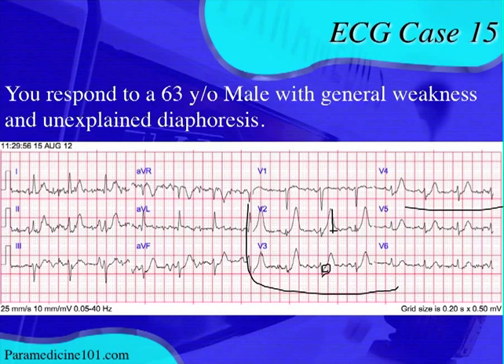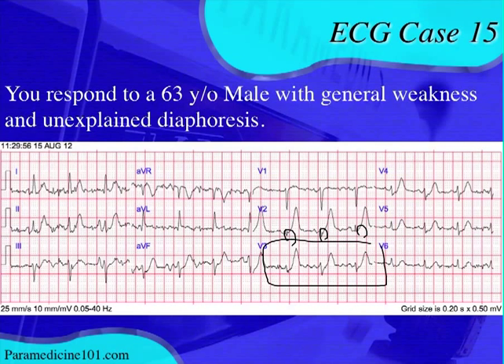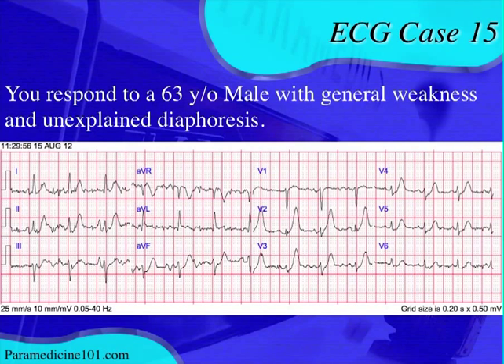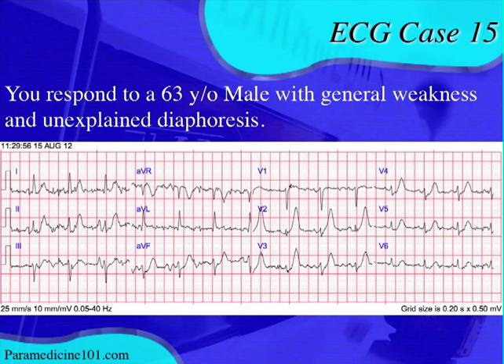Not only do you have symmetrical broad-base T waves, but you also have J point depression. It's hard to see due to the artifact, but the J point — there, there, and there — shows a little depression. You can see it best in V3: the ST segment in V3 is a little depressed, and also slightly in V4. These T waves are very tall compared to the QRS complex — look at the QRS size in V2 versus its T wave. Depolarization and repolarization are usually proportionate to each other.